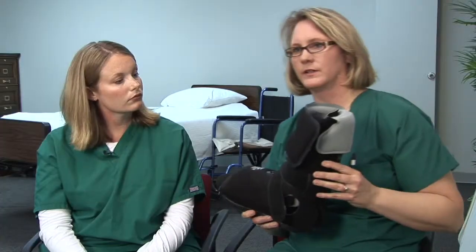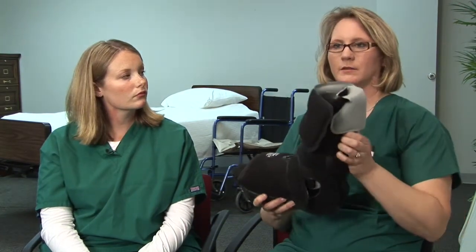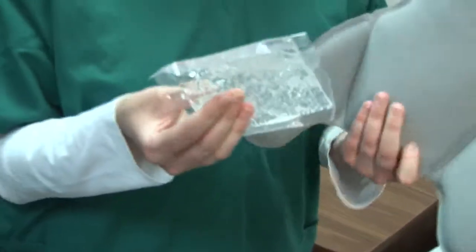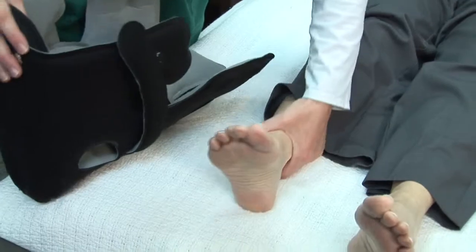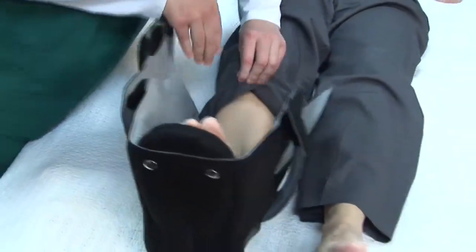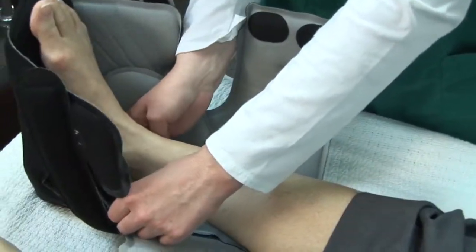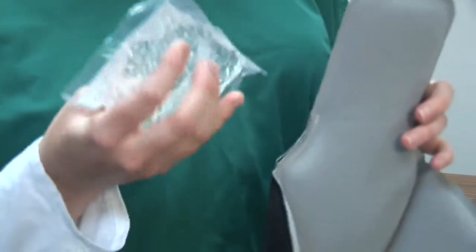It's a heel pressure relieving ankle-foot orthosis, and what that means is that it's actually providing some stability to the ankle. And inside this cushion is the actual gel pack, and it's ideal for the skin or the body to be floating on a fluid surface. So whether that be air or a liquid, it's ideal in the sense that it won't allow for constriction of the blood vessels from impingement from any kind of firm or hard surface.